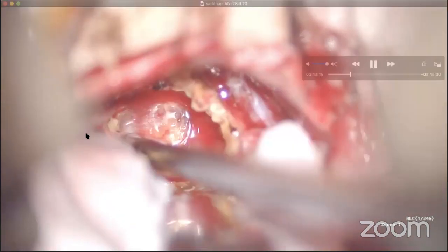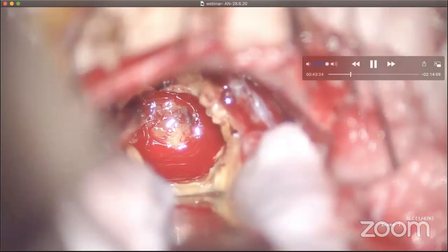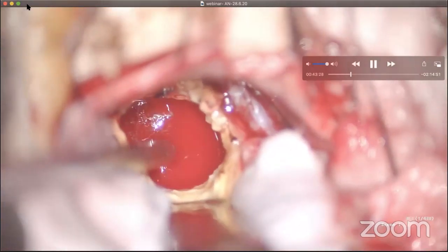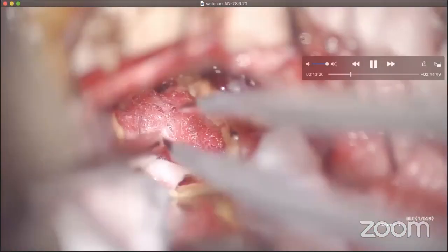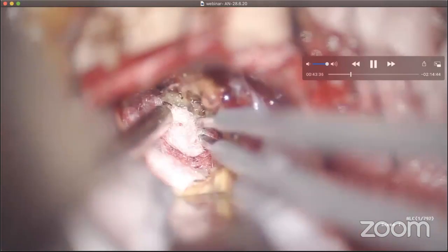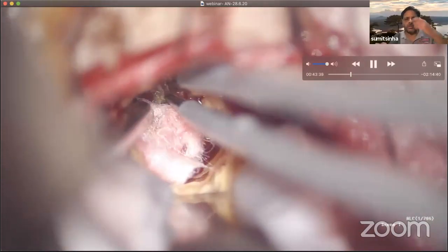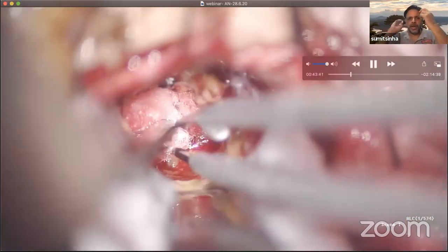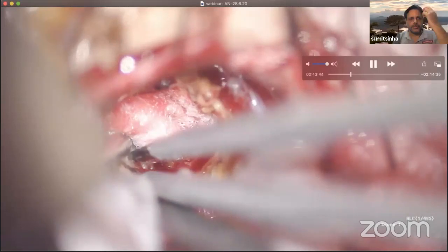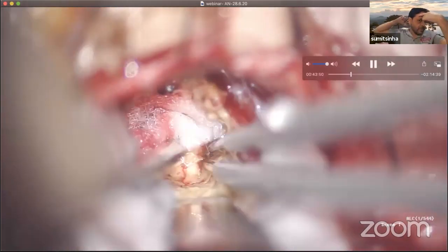There's a couple of questions in the chat, if you'd like to answer those, Sumit. Okay, V asks, would you always prefer to keep two pins of the Mayfield head holder above the forehead? Okay, so in the lateral position, I prefer to take one pin at the back and two pins in front like this.